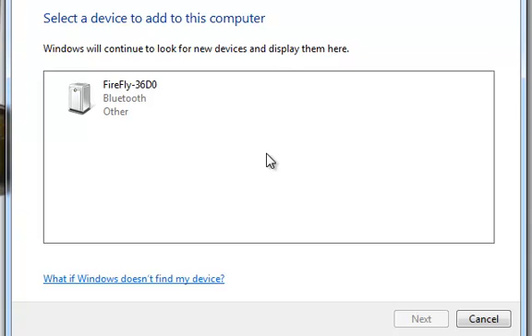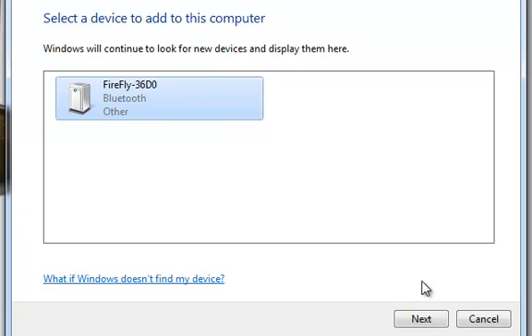I select the Shimmer, as denoted by the name Firefly, and click Next.